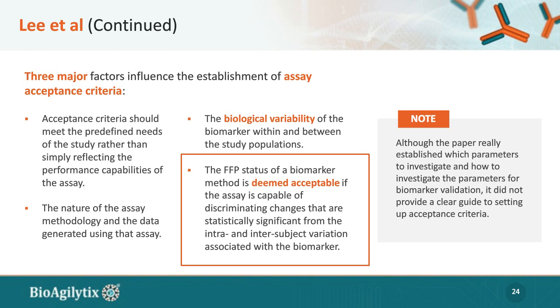Although the paper really established which parameters to investigate and how to investigate the parameters for biomarker validation, it did not provide a complete, clear guide for setting up acceptance criteria. And I'm not here to say that we can ever come up with a clear guide.